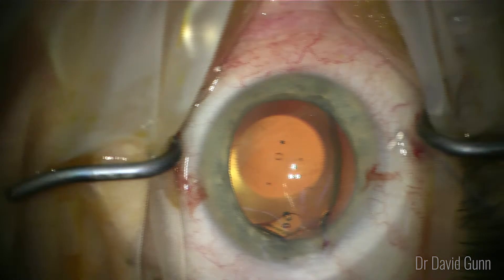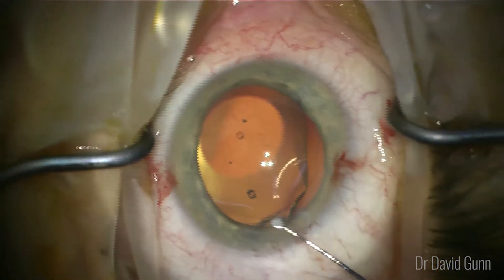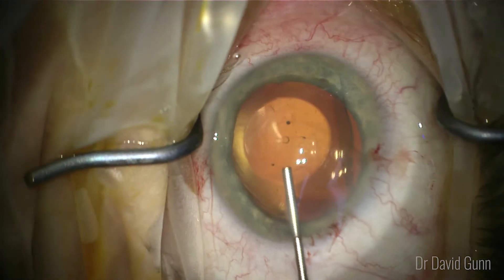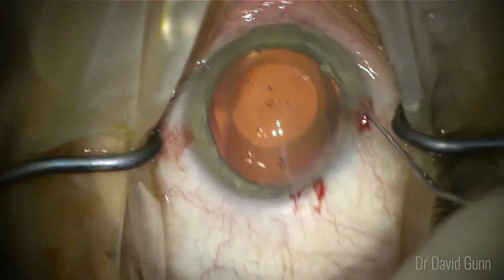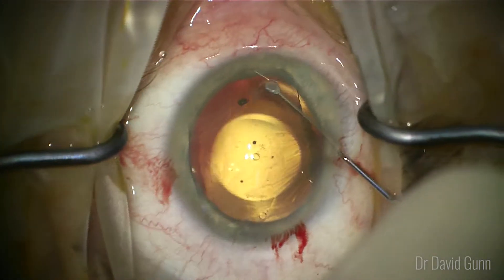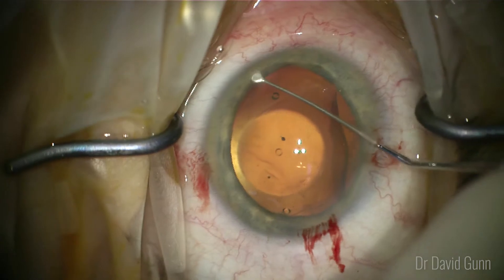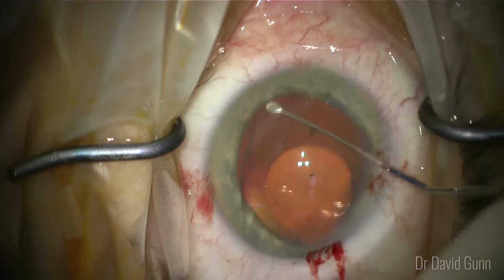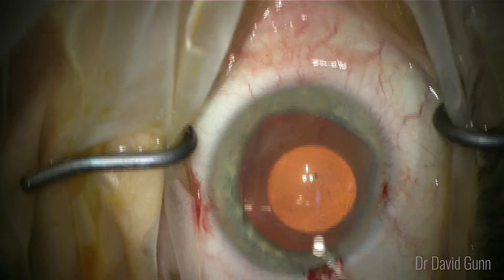At this point we have a paddle manipulator that we can use to gently insert the haptics. The main aims here are to not touch or damage the crystalline lens. Take your time when you're doing the surgery. Here we're putting more viscoelastic in front of the ICL to push it slightly posteriorly, then using the paddle to gently manipulate the haptics to go behind the iris. It's important to have good pupil dilation or this step can be very difficult. You can use intracameral phenylephrine or the standard preoperative drops.